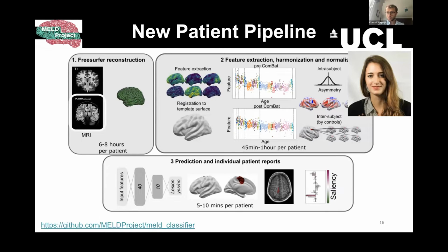That's a great question. So when you said different scanners, harmonization is done per scanner. So if you have multiple scanners at your site, you would need a kind of small harmonization cohort per scanner. I think in general, motion is not something you really want. There is a QC step that we put later on, and one of the features that we originally found was quite bad for detecting lesions you might expect is motion.